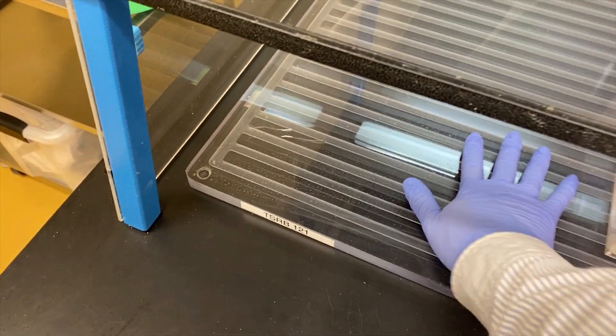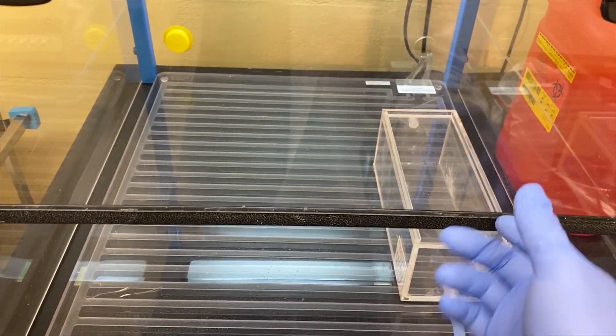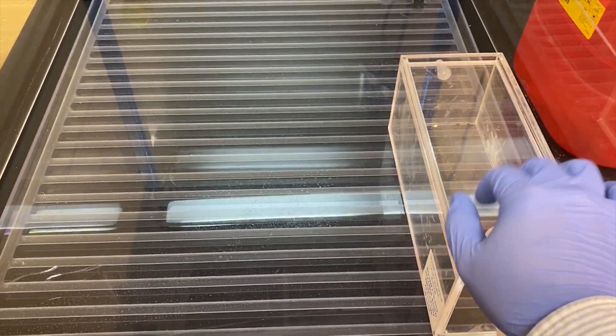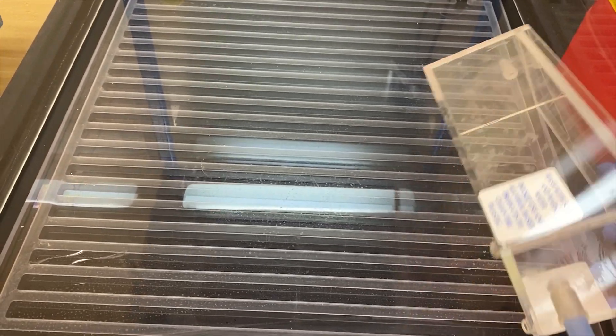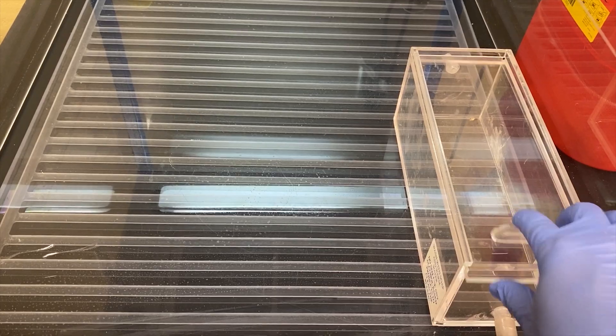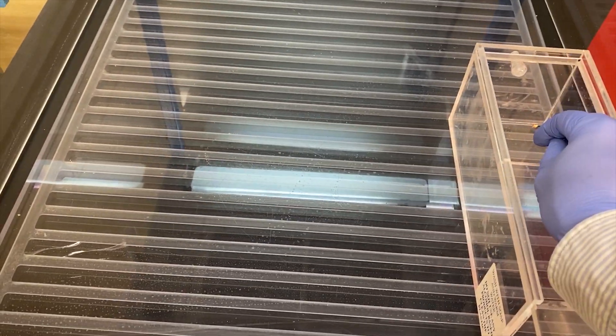So this device will warm this pad to keep the mouse temperature. And here it's a cage. This cage is to store the mouse, put the mouse in this cage.